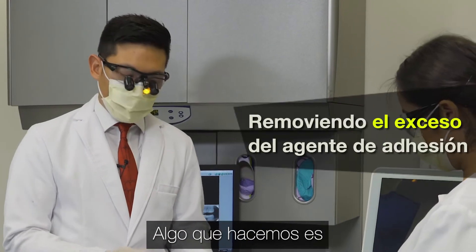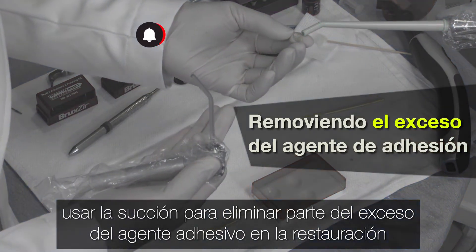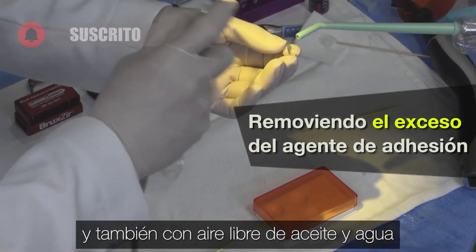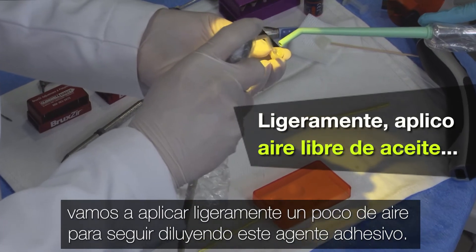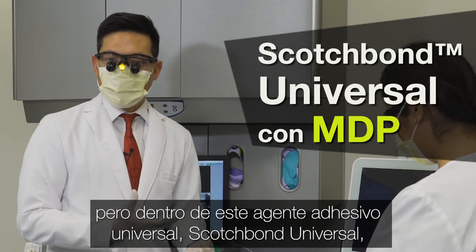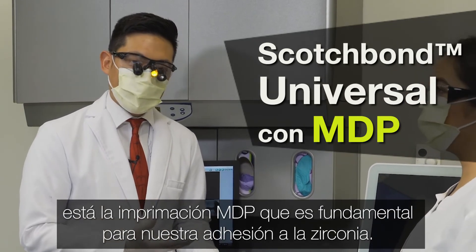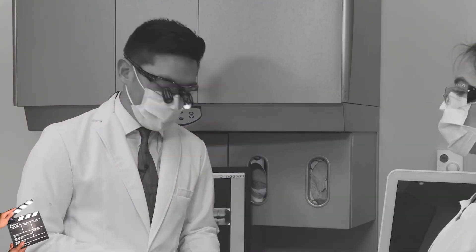We'll use suction to remove some of the excess bonding agent on the restoration, and also with oil and water-free air, we're going to lightly apply some air to continue thinning out this bonding agent. The resulting layer will certainly be the bonding agent. Within this universal bonding agent, Scotch Bond Universal, there is the MDP primer, which is critical for our bonding to zirconia.